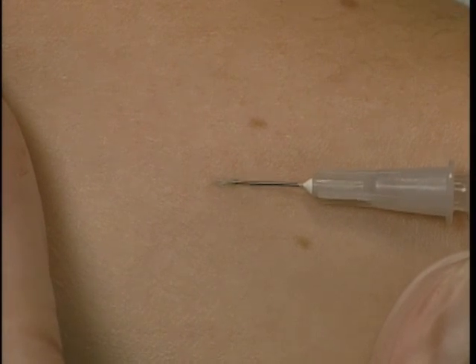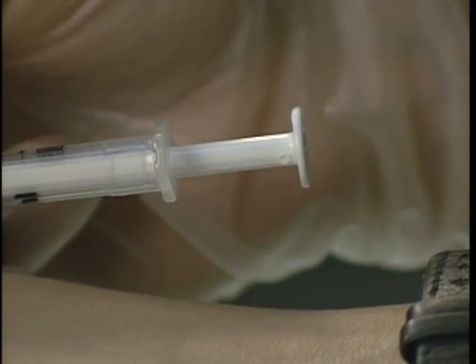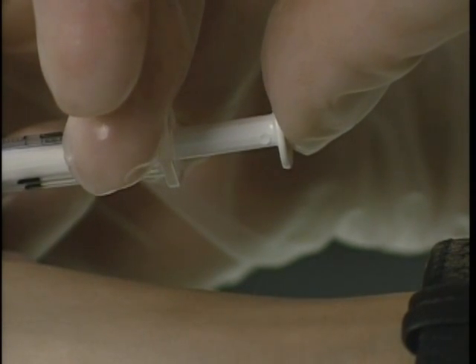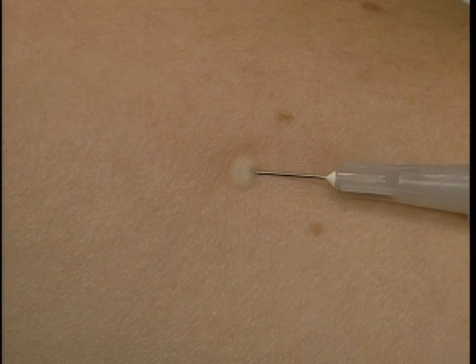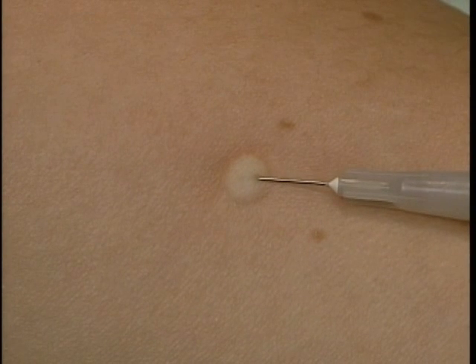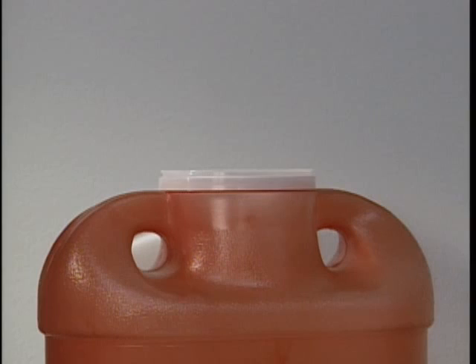When the needle is inserted at the correct angle, you can see the bevel of the needle just below the skin surface. Next, release the stretched skin and hold the syringe in place on the forearm. Grip the flange of the syringe between your first and middle fingers. Use your thumb to press on the plunger. Now, slowly inject the tuberculin solution. You should feel fairly firm resistance as the tuberculin enters the skin. A tense pale wheal that's 6 to 10 millimeters in diameter appears over the needle bevel. Remove the needle without pressing or massaging the area.